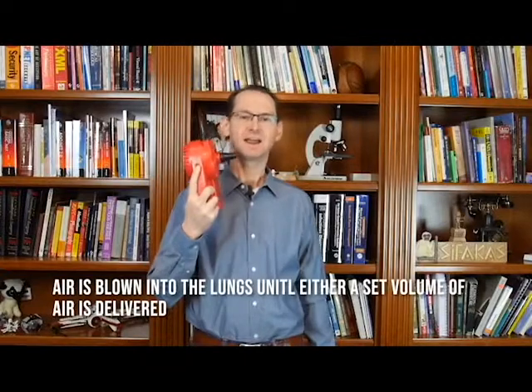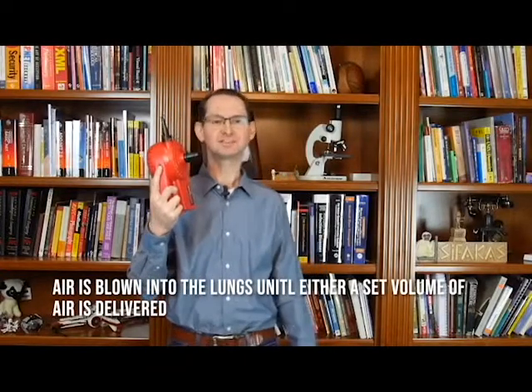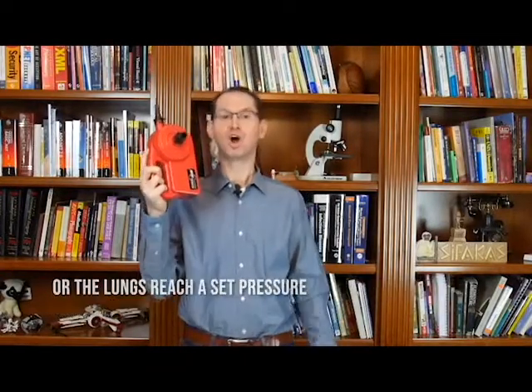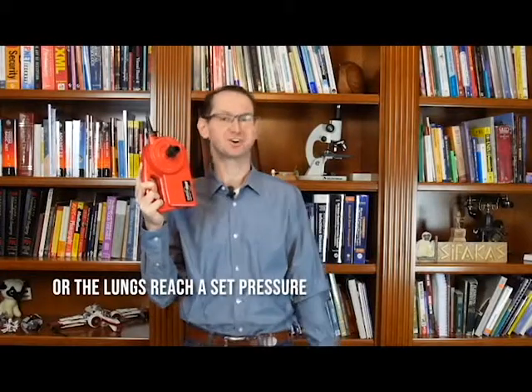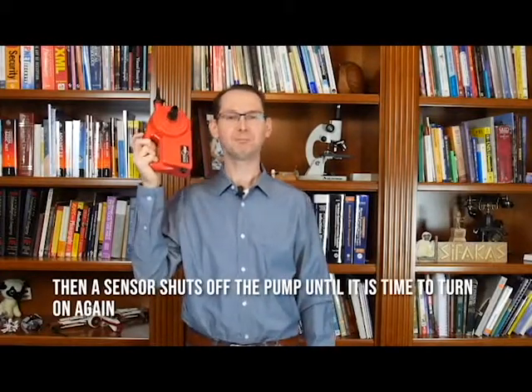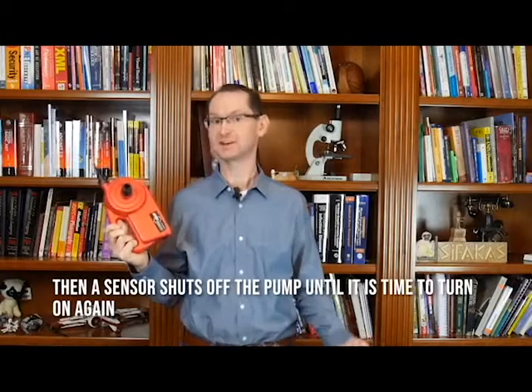So to understand how a ventilator works, think of it as an air pump. This pump can generate air flow and it has a switch to turn it on. The air switch is controlled by a timer that turns on the pump a set number of times a minute. Once the pump is on, air is blown into the lungs until either a set volume of air is delivered or the lungs reach a set pressure. Then a sensor shuts off the pump until it is time to turn it on again.